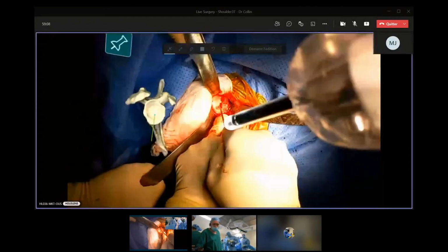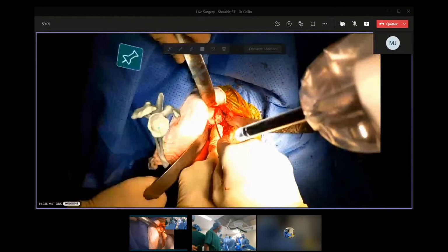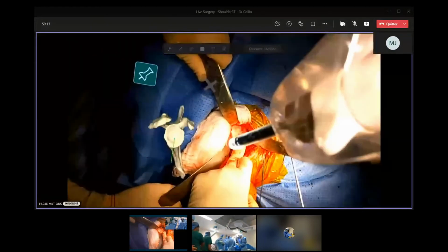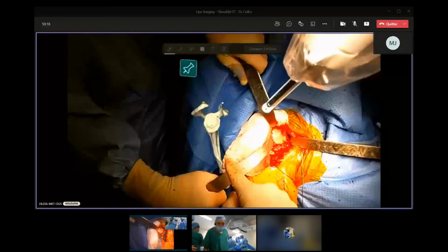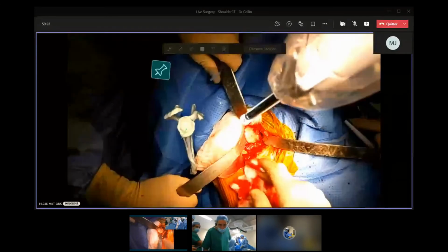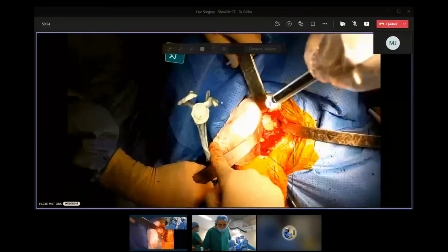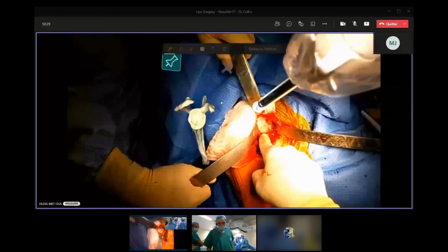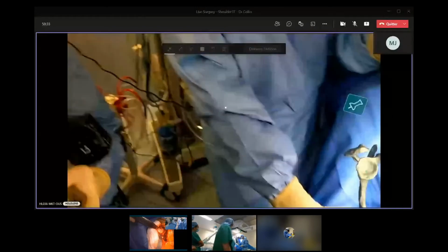Question, Philippe. Yes? You reproduce, but you know the distance between inferior and the center point? No. You have no distance. You just have the visualization of this and this. Yes, but you can put the entry point 2 millimeters up or 2 millimeters down. Yes, it is not guidance, I agree.